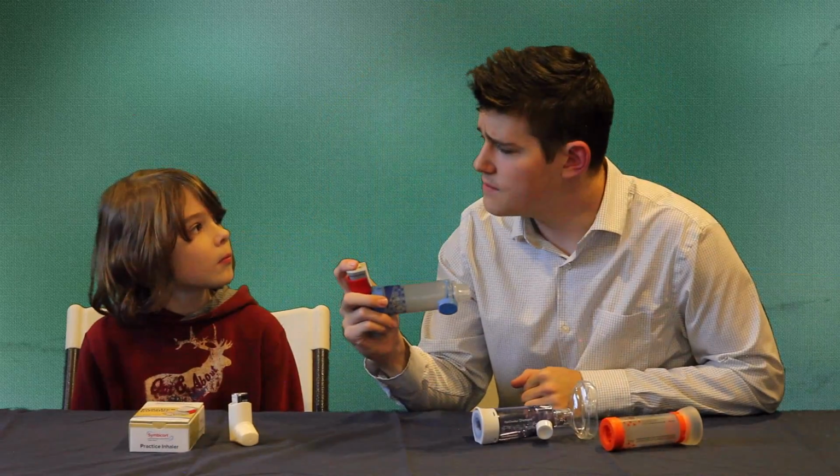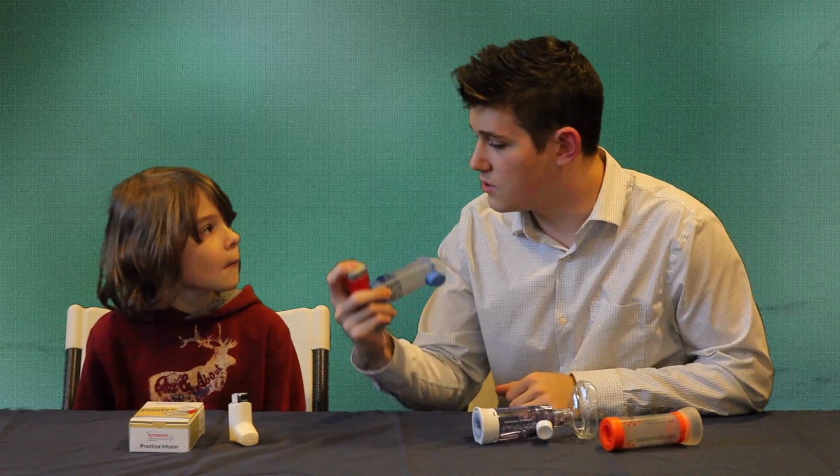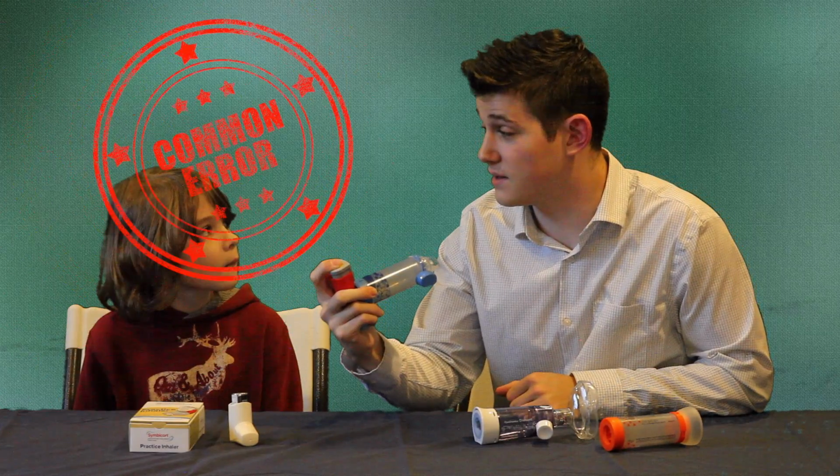So you just sprayed all the medicine in and started to breathe, but you still need to get all that medicine in. So after you press down, you take a big, deep, slow breath in.